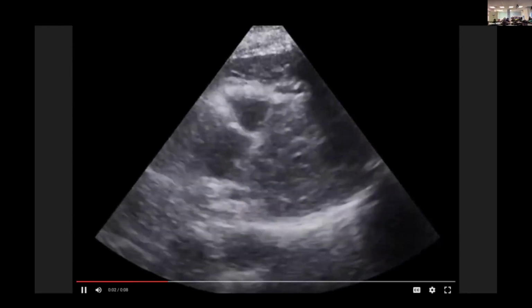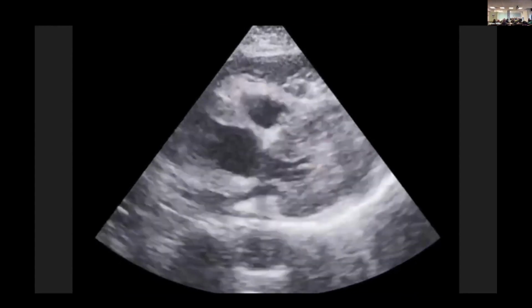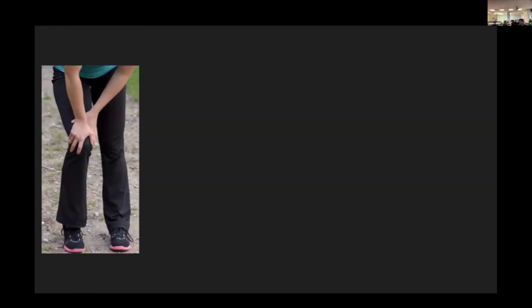And this is what you see on the subxiphoid. So here you see a large pericardial effusion. You see some hyperechoic areas in there. And the aorta looks a little dilated to you. Just like real sound. Because in reality, you are freaking out at this point, all right?